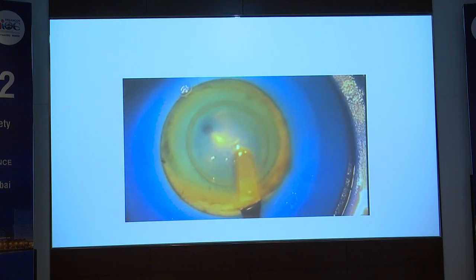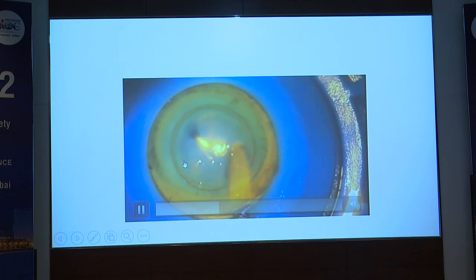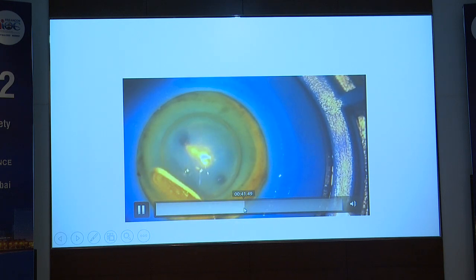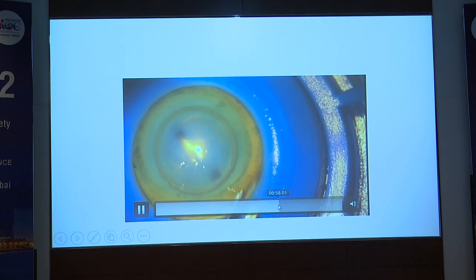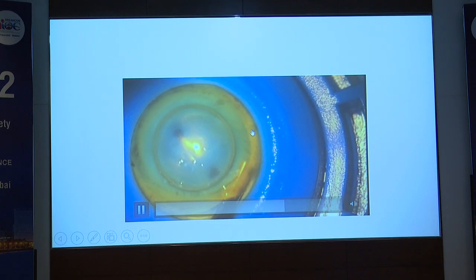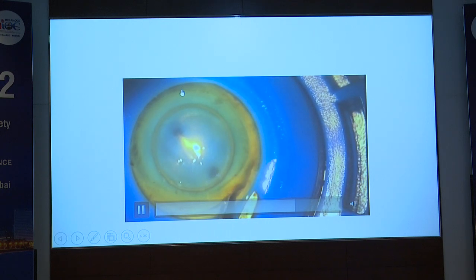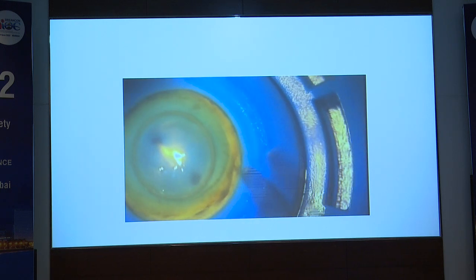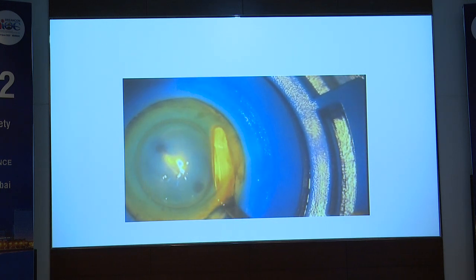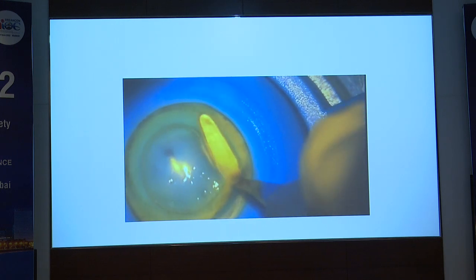However, the trick is once you reach nearly around half of your area, you would see that it's difficult to now proceed to the other half of the cornea. In which case what you can do is just cut across using your corneal scissors. You can increase the wound size. You can just cut across the wound so that now you have an easy access to reach the other side of the cornea to complete a dissection 360 degrees. So you don't require any special dissectors. A simple crescent knife by itself can help you to complete a 360 degree dissection of your donor cornea, which you can now use for the DSEK surgery.